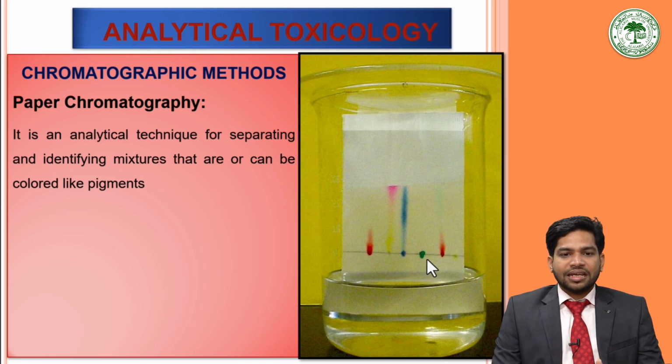So here you can see, as in the earlier example, paper chromatography is used. The solution is kept on this line and this is put in the mobile medium, and the mobile phase will travel on this stationary medium and take the different solutes along with it. Depending upon their distance we can judge what type of compounds this mixture contains. By this method paper chromatography is applied.